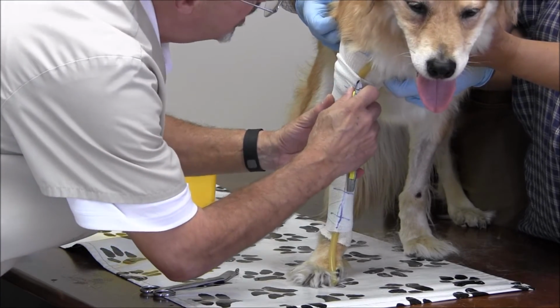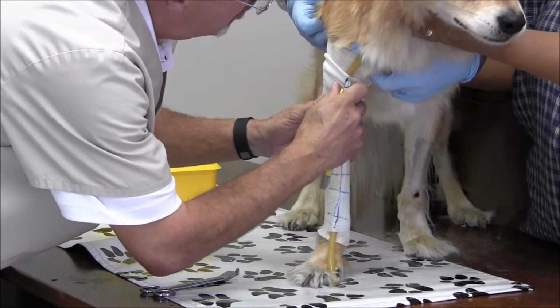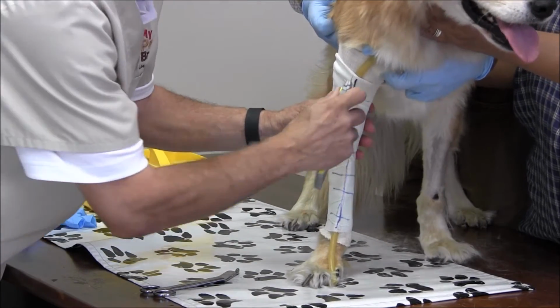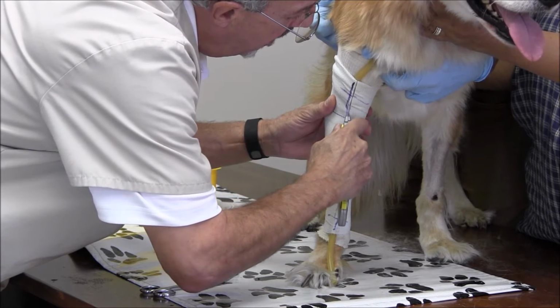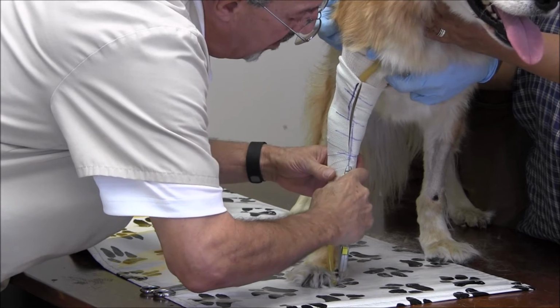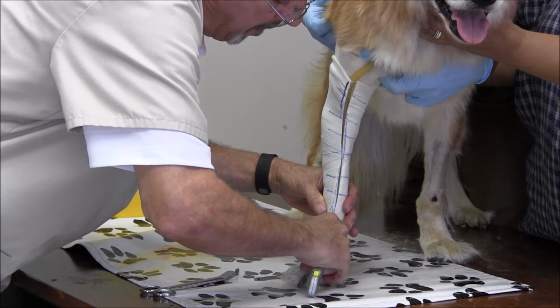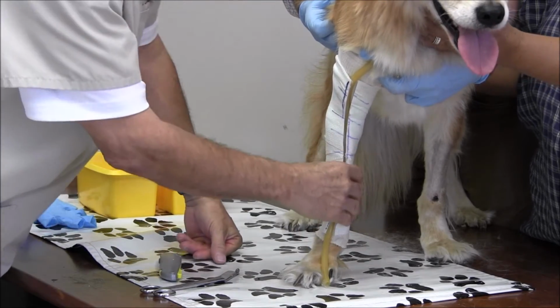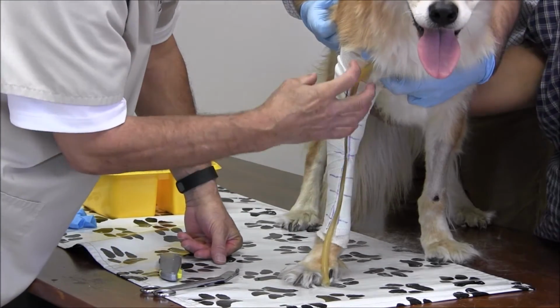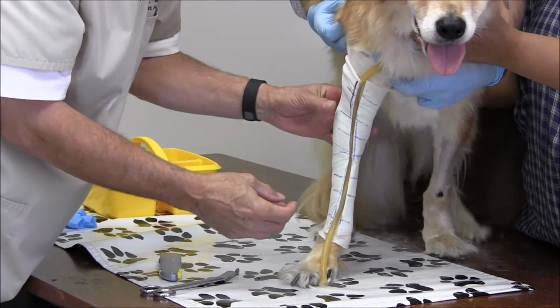So we'll start proximally or distally, whatever you'd like. And we're going to use a very sharp razor knife. We're going to cut down on the tube without cutting the dog's leg. That's why we have the tube there. And it's still not totally hard yet, but if you get it when it's just a little bit soft, it will be much easier to cut off.